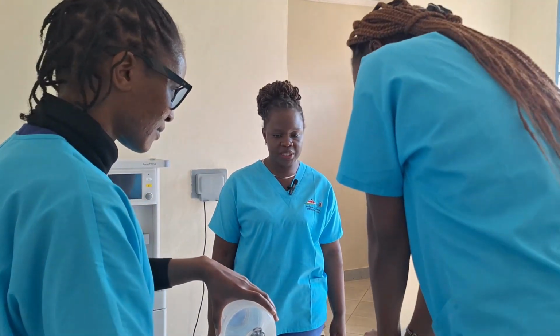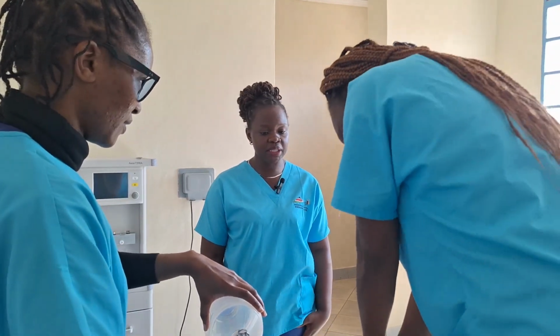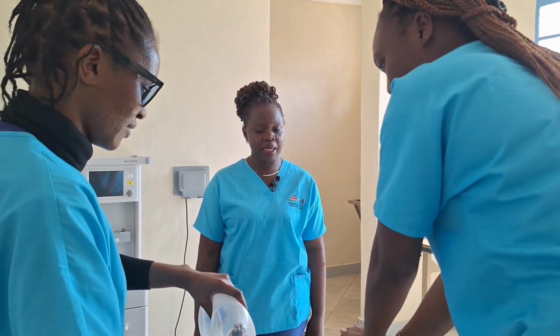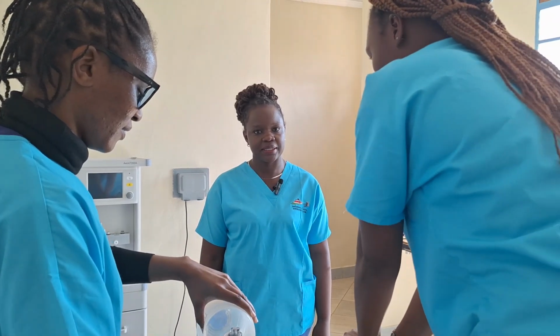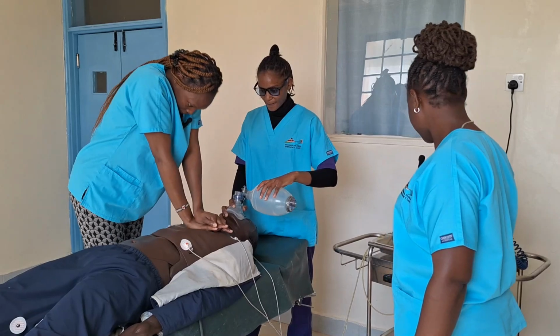So team, we've just delivered the first shock. We have the next 2 minutes before another pulse and rhythm check. In the meantime, we can start thinking about the H's and the T's. Well done, team. We are now into 2 minutes of our CPR.